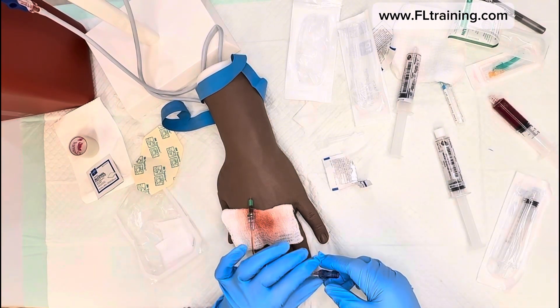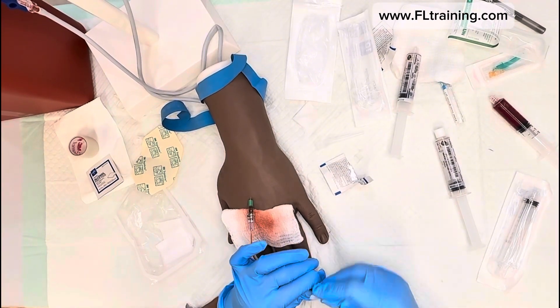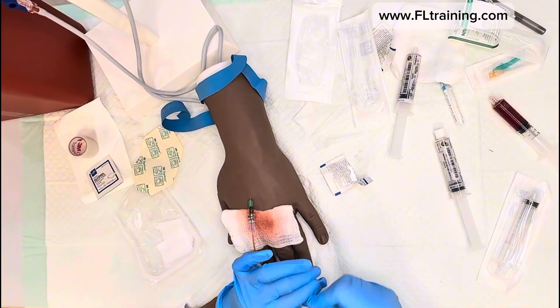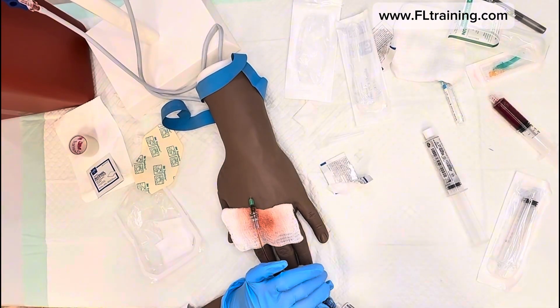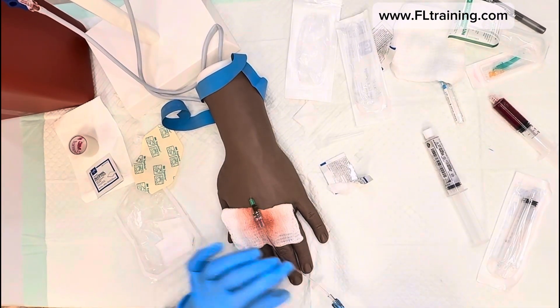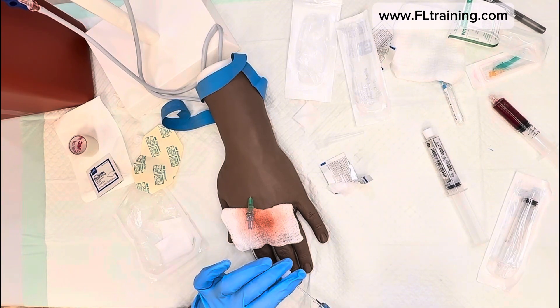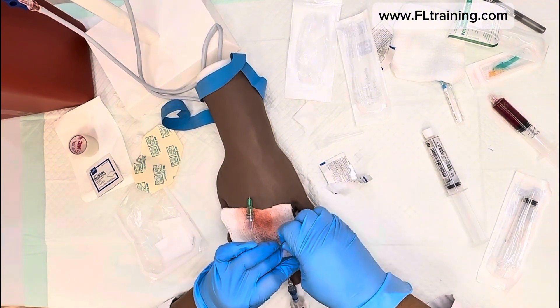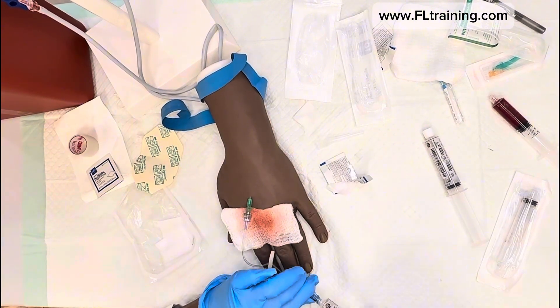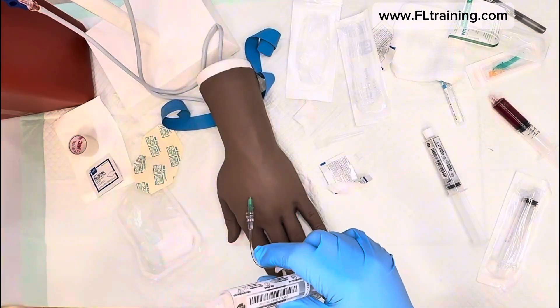I'll transfer that into my collection tubing. Get a new alcohol swab — not off the table like I just did; this is just for classroom purposes. Scrub the hub again, then flush the IV line one more time. When flushing, clamp it off to prevent blood from getting back into the tubing.